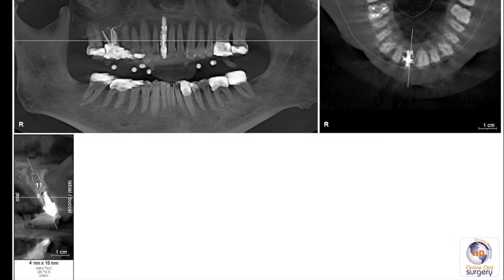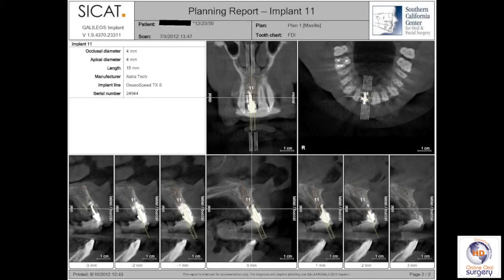A case like this really demonstrates where 3D imaging, implant planning, and guided implant surgery really shine. We want to place our implant as precisely as possible to get the best overall result, both aesthetically and functionally. I've been able to plan my implant placement very precisely, taking into account the parallelism to the adjacent roots, making sure I'm equally spaced between the adjacent roots, and that I'm well within the alveolus with at least 2 millimeters of bone on the buccal and the palatal. The long axis of the implant is coming out the incisal edge of the crown, since this patient's dentist would like a cement-retained prosthesis. If the plan is to do a screw-retained prosthesis, then we want to place the central axis of the implant to come out the cingulum area of the crown.